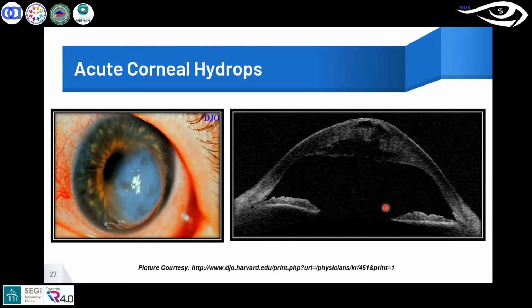This AS-OCT technique is used for determining the corneal thickness, or the depth of DM detachment. If there is any DM detachment, you can analyze the depth. And if there are any DM breaks, they could also be visualized by using the AS-OCT technique.